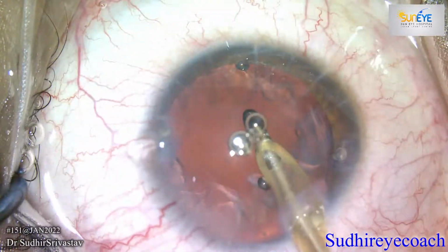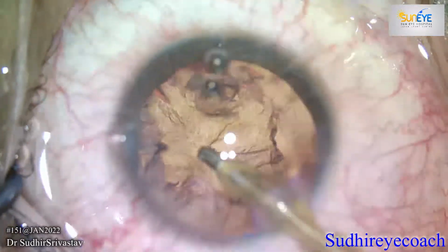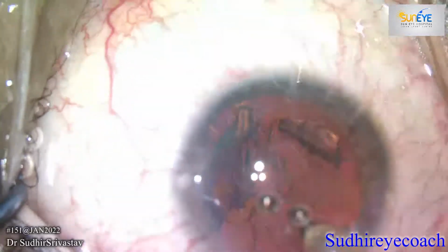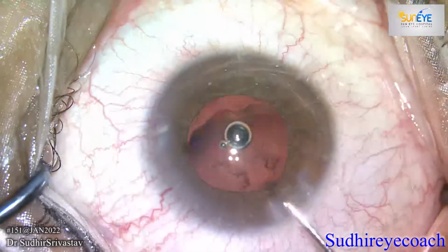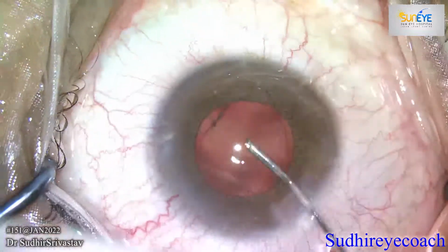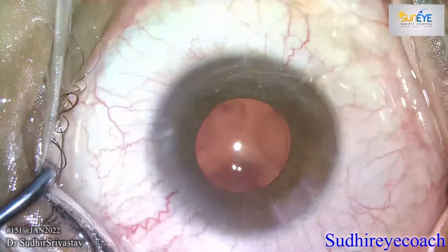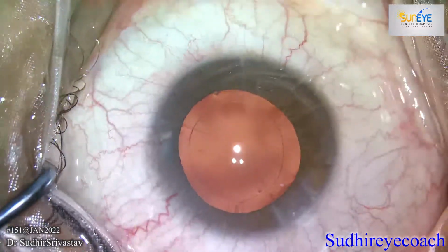So I selected Master readings for radial keratotomy, and Master was not accepting the radial keratotomy mode. Therefore, I calculated on the Barrett suite and added +3 diopters to achieve the IOL power. And because too much flattening of the cornea creates hyperopia, always target -1 or -1.5 diopters of myopia in the post-operative period. So the rest of the surgery remains the same.